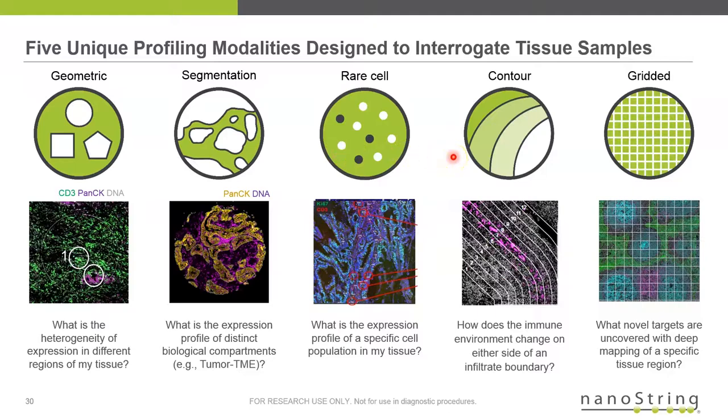And then there's a variety of other tools that you can use to look at other aspects of the biology within the sample, shown here with the contour and the gridded profiling.